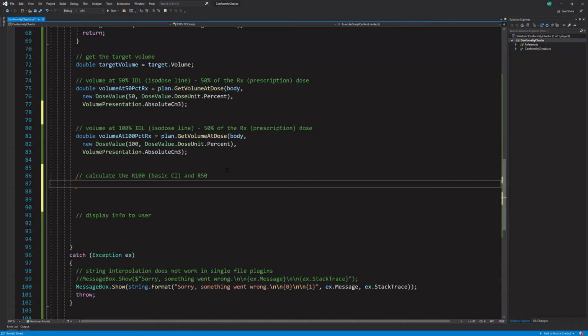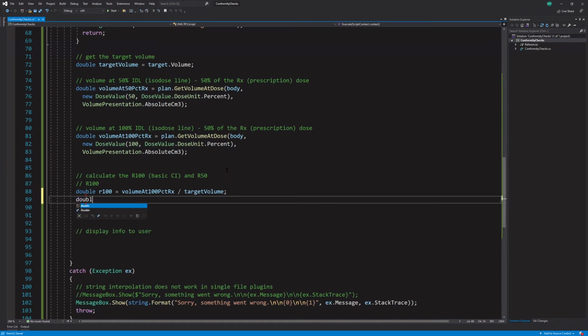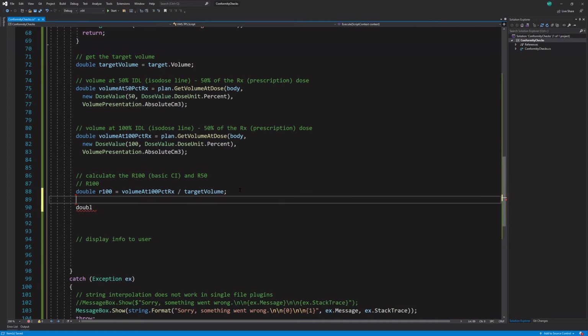Okay, so the R100, so we'll say double R100 equals the volume at 100% Rx divided by the target volume. Okay, and then so let's add a comment. The R50, so double R50 equals volume at 50% Rx divided by target volume.